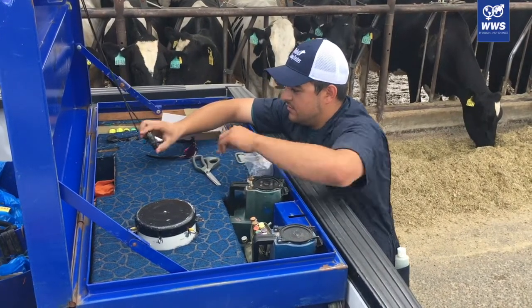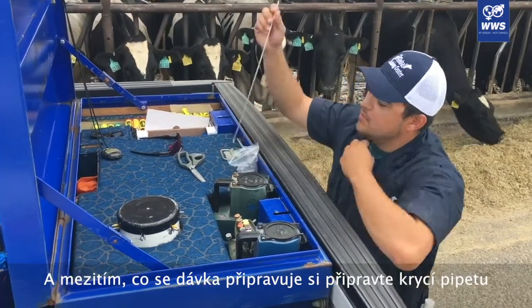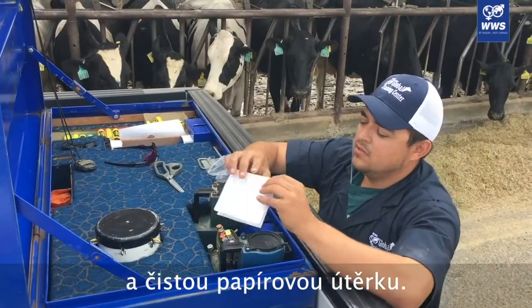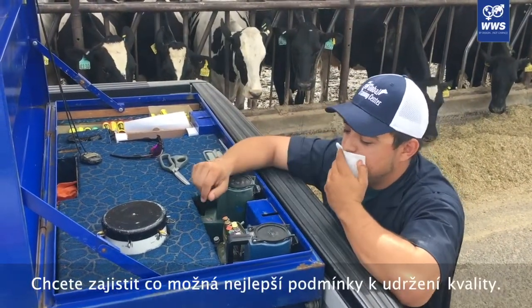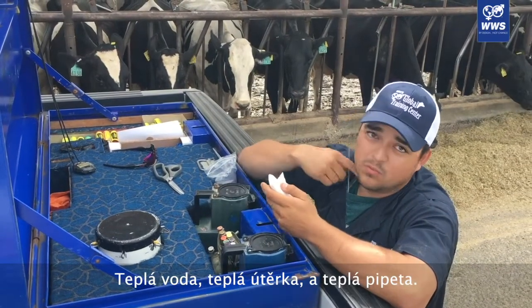We're going to wait 45 seconds, and while that's thawing, pull out a straw, get a paper towel. We want a nice warm paper towel so we can keep it warm — warm water, warm paper towel, warm sheet.